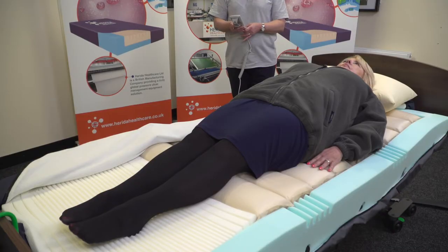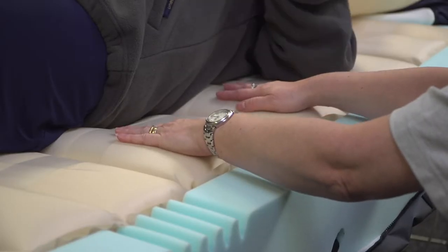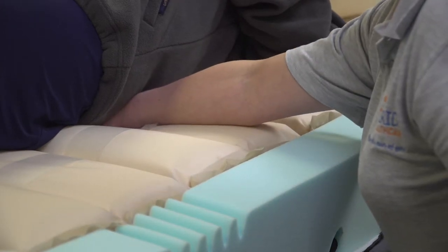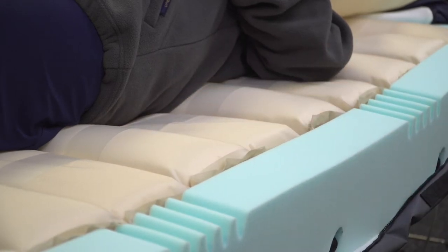The patient we are currently demonstrating with is in the supine position, and you can see that every other cell is deflated. Placing a hand between the body and the deflated cells, we can feel and see that there is sufficient clearance, providing the patient with relief. The rapid cell deflation system is unique, as pressure relief happens much quicker than on a standard dynamic system, offering immediate relief.